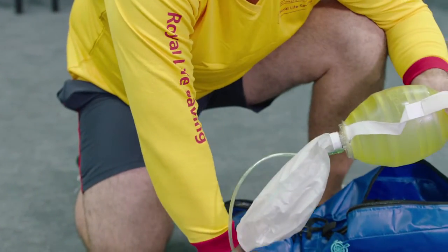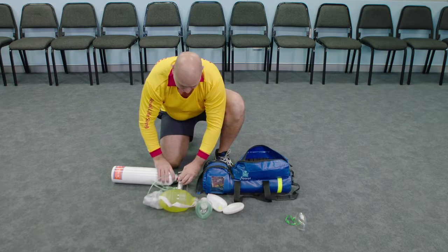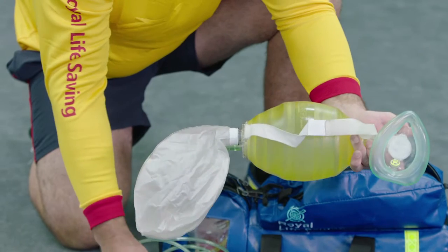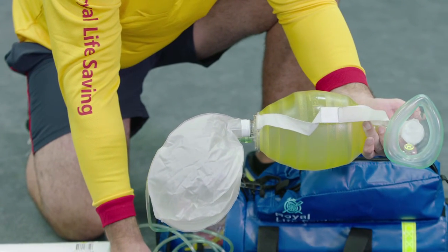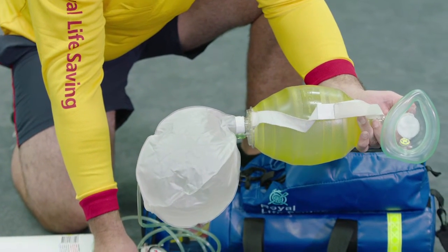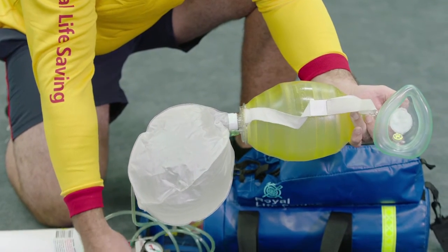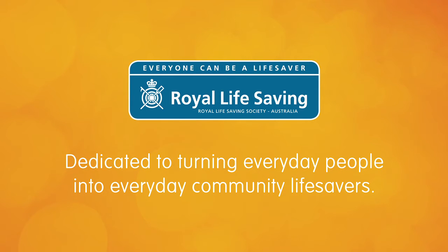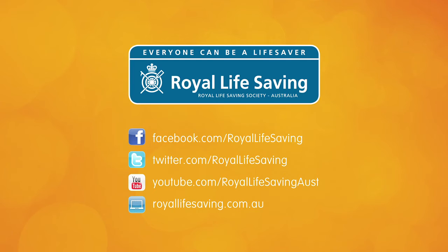When all components have been connected correctly, the reservoir bag should inflate when the oxygen is flowing.